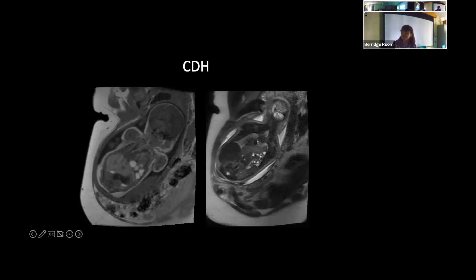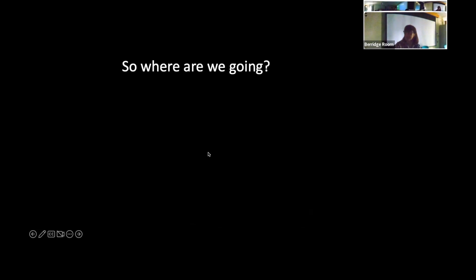This is another really unusual case. This came through as a late diagnosis of a diaphragmatic hernia. There was mediastinal shift. And the fetal medicine specialist doing the scan said to me, you may think I'm mad, but it's not quite right. It doesn't look quite like a CDH, but I don't know why. And this is actually a pericardial tumor. This is actually all in the pericardium. So it was shifting the mediastinum across. It was a cystic abnormality, which was mimicking the bowel, but definitely worth finding out. So the MR was pivotal in getting her to the safest place for delivery of her baby.